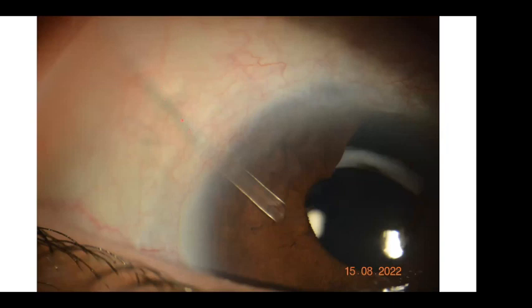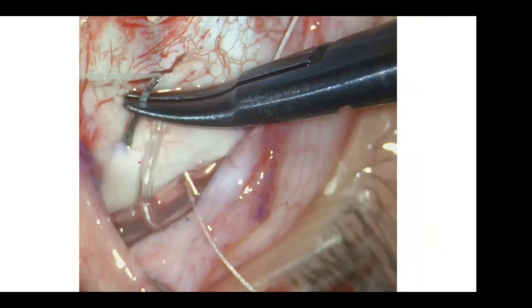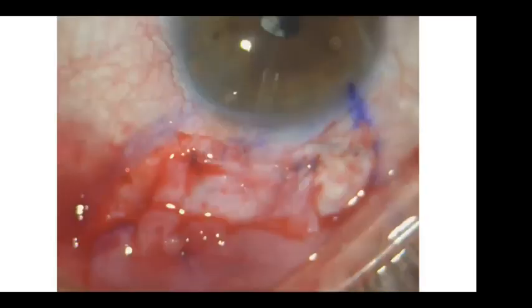And this operation was about 1.5 years ago. I really don't know, but this could be further improved if you dissect the sclera deeper, so that with experience you can handle the sclera to have the tunnels deep and you have the flap deep as well. In the old days, I used to push the valve and then put the scleral suture. Definitely, this is not easy. When you ask the scrub nurse all the time to push the valve posterior and then try to find the space for the suture. That's why the pre-placed sutures before putting the implant actually facilitated my life.